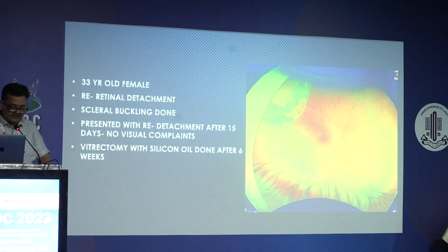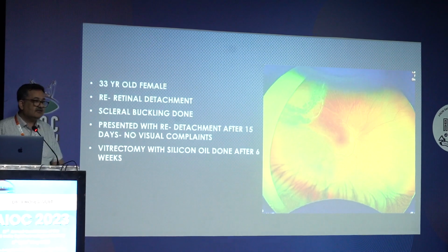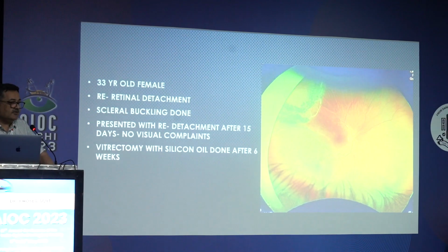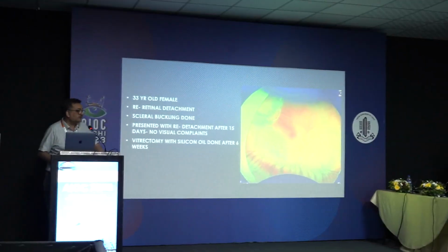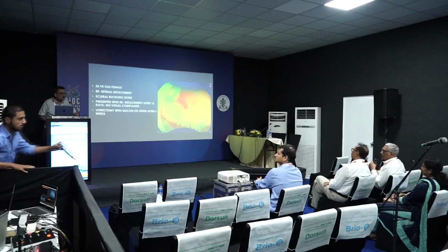Now, the thing is that this patient is not giving any history of laser. So is this a deep, self-limited, new lesion? Do you try to find the break here or there? Dr. Bhinde, any advice to a resident on where we should suspect? I think with just one picture it is difficult to comment.